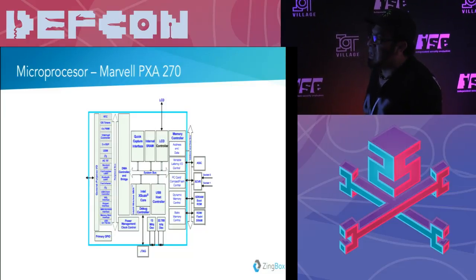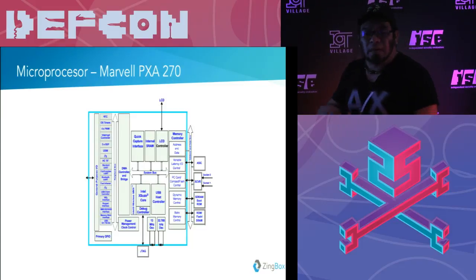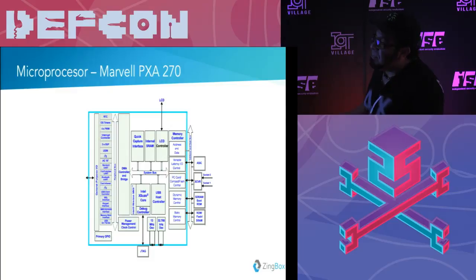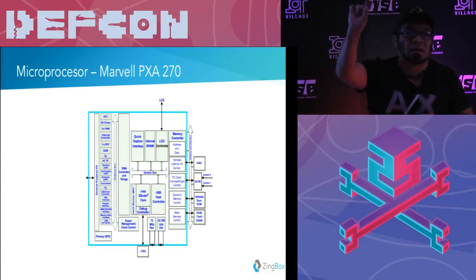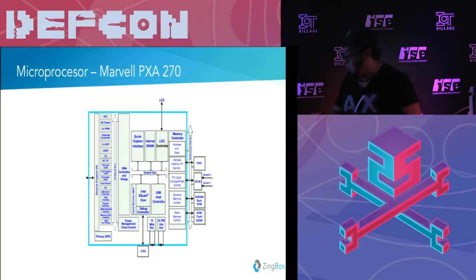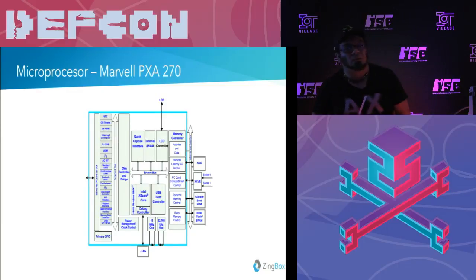Here are a few more details of the internals. Here is the JTAG that I mentioned so that you can interact with the processor. But unfortunately, with that debugger that I mentioned, you cannot do it through JTAG. Here is the PC card. This is very important, guys. Inside the pump, you will probably see it here in a second, it uses this small compact flash card. That compact flash card, as you can see, is mentioned here. That one is able to boot the operating system. The operating system is inside that card, which means you can play around with it. We will see how. Obviously, it has an LCD, it has RAM, it has DRAM, and it also has a flash RAM that we will see how we can play with.